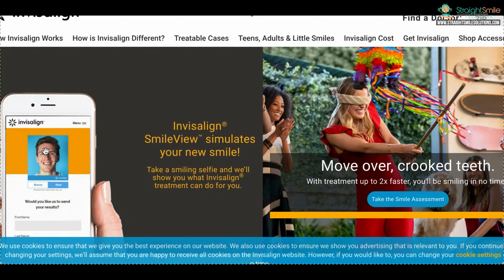Because at this point, the patient is going to have to answer a lot of questions about wear frequency. They're going to have to scan the barcode on the bag of their aligners in order to add it, or type in some information. I can't see patients doing this independently without you basically looking over their shoulder. It's just not going to happen, unless they really, really wanted it. But I think the vast majority of patients feel very uncomfortable about having to do this kind of stuff.